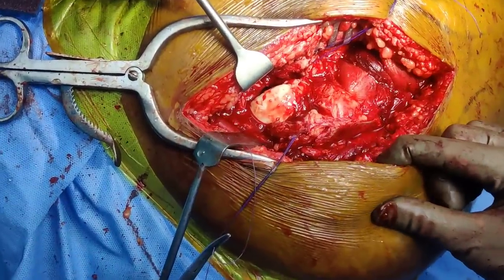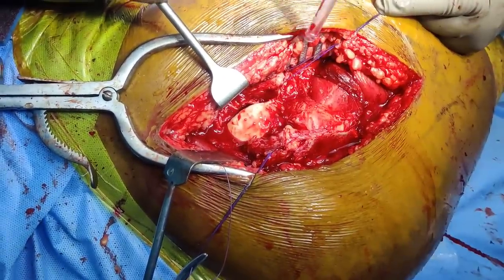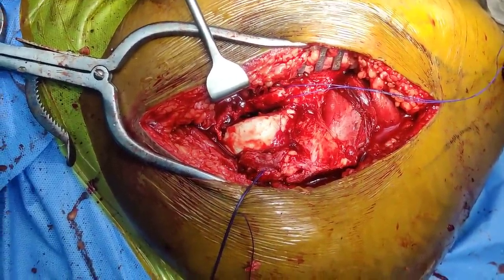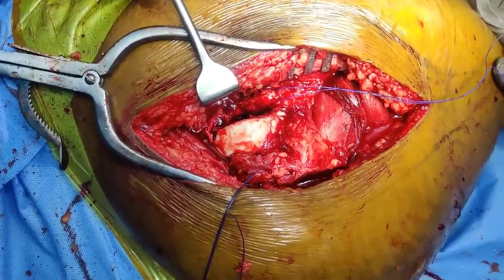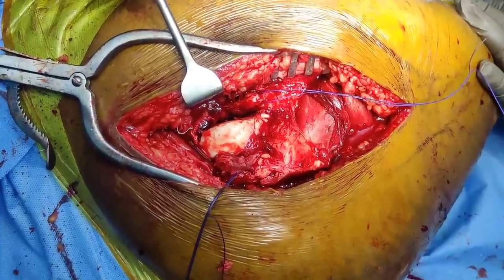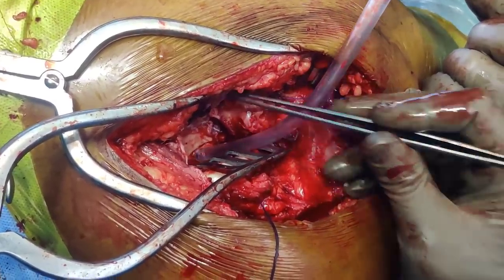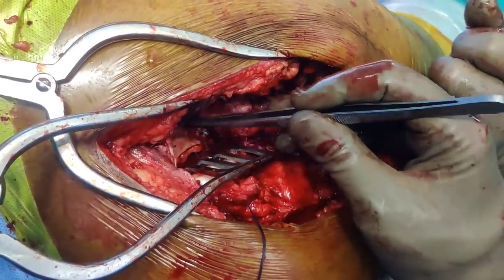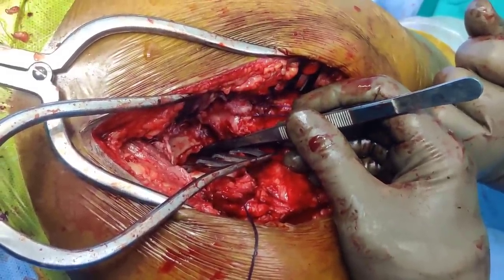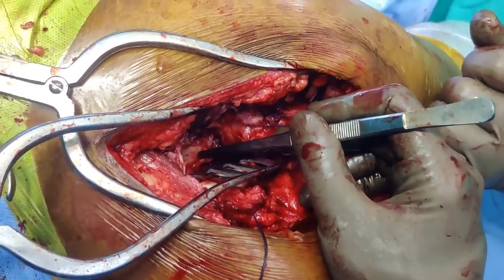The head is nicely subluxed but this patient has a really bad fracture of the femoral head which we need to address. The next step will be to extract the head component from the acetabular area and then fix the head with a Herbert screw. We will extract the loose femoral head and fix it. This is the femoral head and this is the remaining part of the femoral head inside the acetabulum. Since this injury is 20 days old that adds to the challenge. We will use a homan or ring handle spike to elevate it, take it out, and fix it.